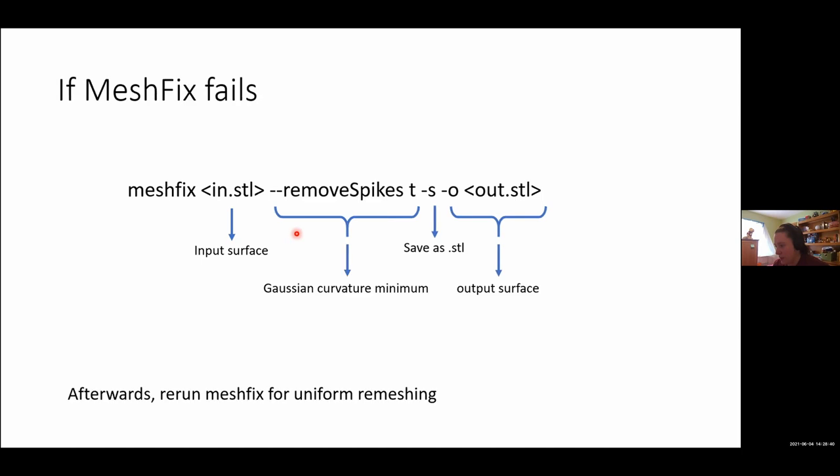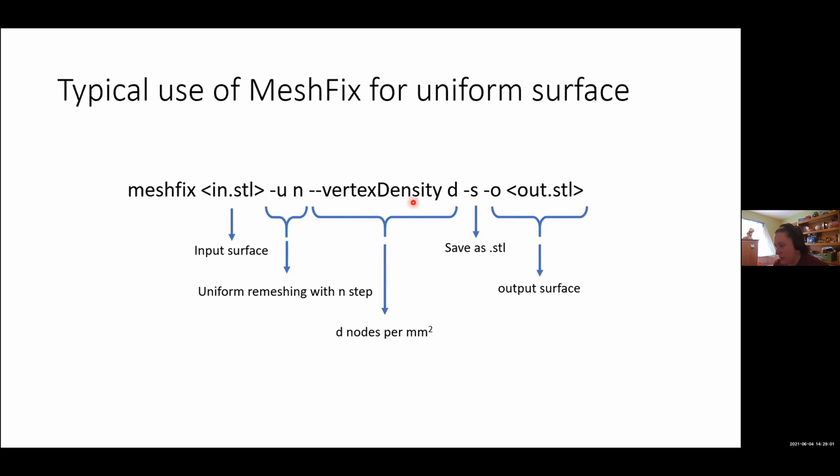Now, if it happens to fail, and it will fail sometimes, you can do a quick step in the middle, which is MeshFix, where you remove spikes. MeshFix recommends the value of 5.5 for this T, and I've found that that works quite well. And then we'll go back and rerun the previous step with the uniform remeshing.